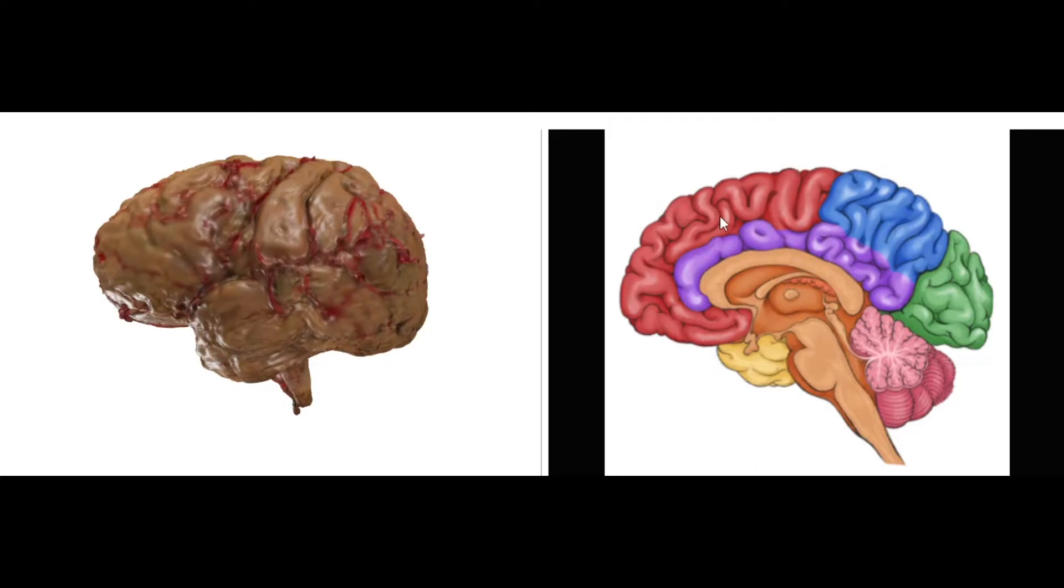So the first thing is, the brain itself is divided into different lobes. So we have the cerebrum or the cerebral cortex of the brain, which is labeled here in these green, blue, red, purple, and yellow colors. This is the cerebellum, this is the brainstem.